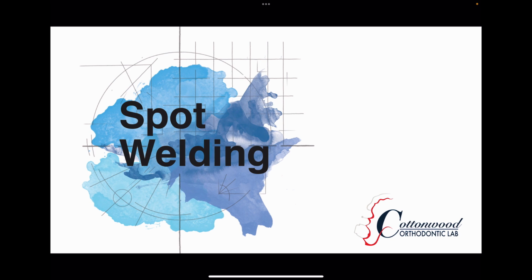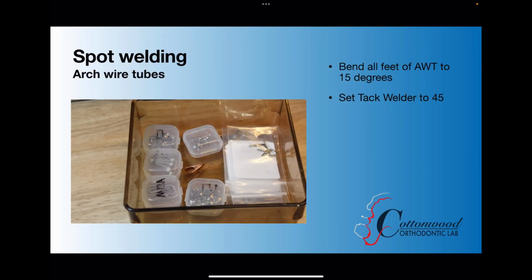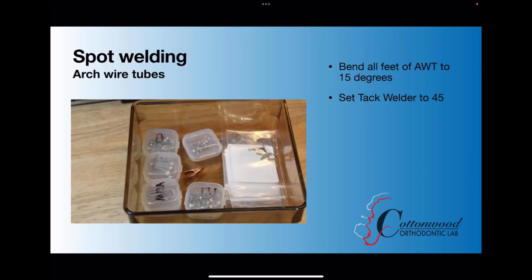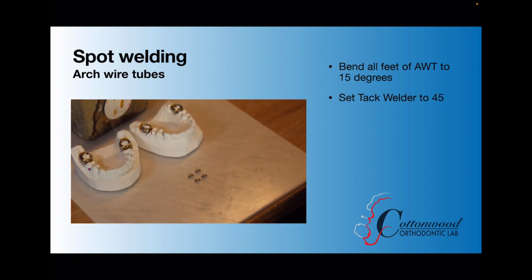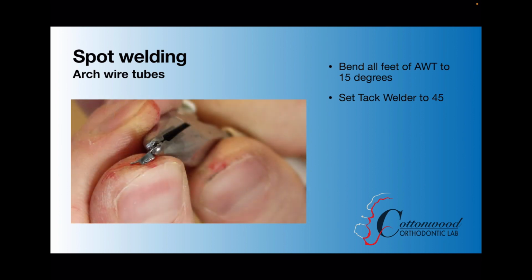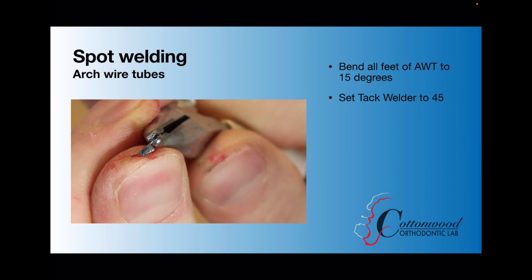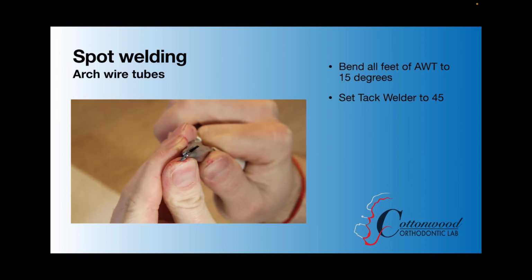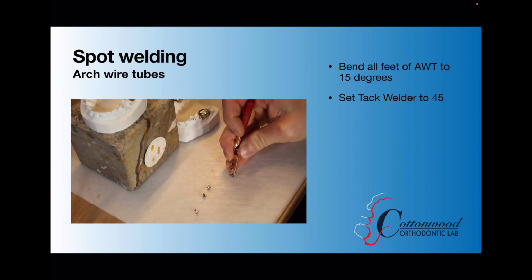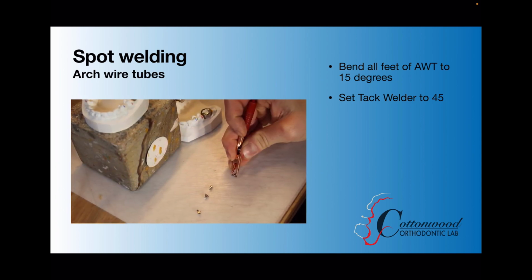So next we're going to go on to spot welding. Here we're going to get to the foundation of our appliance. Really, setting the archwire tubes is the foundation of this appliance, because it's going to set up the rest of the alignment. So first you're going to start out by picking out your archwire tubes. You want to bend those feet to about 15 degrees. This is going to help you have some room for proper tack welding, as well as if you need to laser weld it on there, just to have a little bit more setting. But it really does help make sure that you've got a good tack weld.